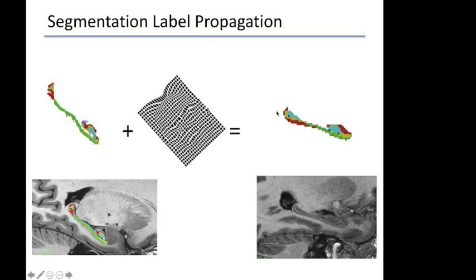Oh boy, that's for citations now. Which type of software is common for registration, segmentation, and cortical thickness using MRI? I'm thinking about using FreeSurfer, but there might be others. So FreeSurfer obviously is very common. The Civet tool out of the MNI and Alan Evans group is very common. That's what we use in my lab.